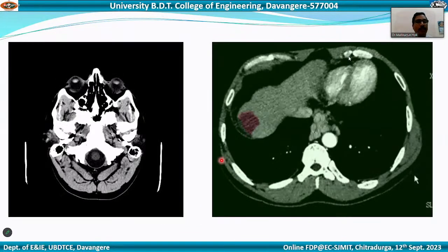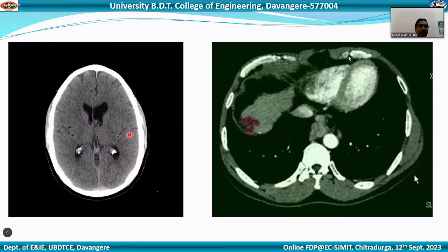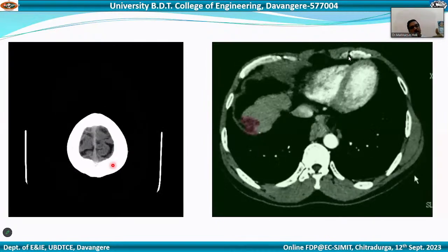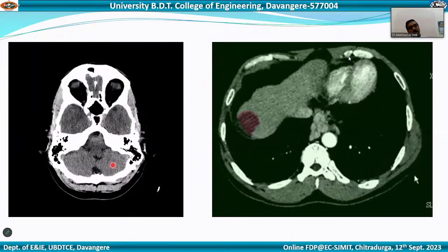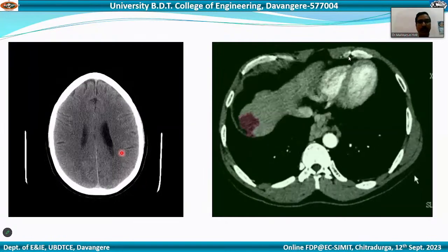Okay, right. So this animation is going to give you a clear picture. This is the slice by slice information of a brain CT. At different slices, you can visualize different things. The doctor is going to visualize all the slices one after the other, and find out in which particular slice there is an abnormality.